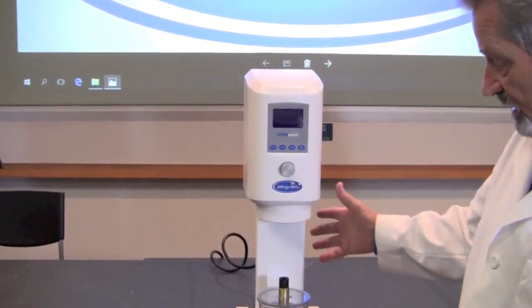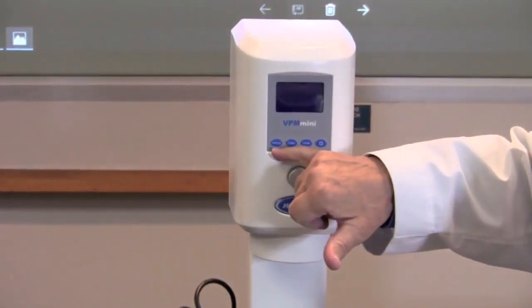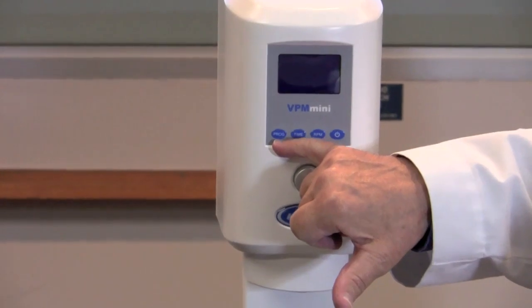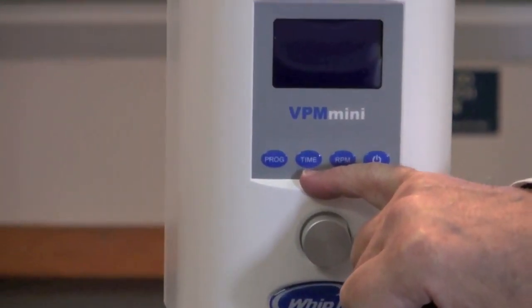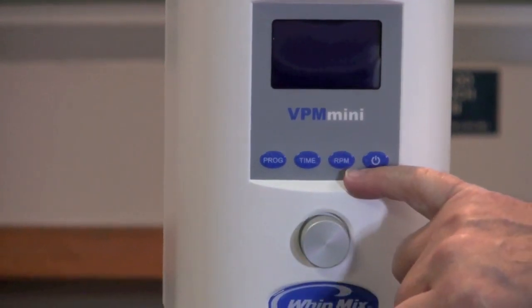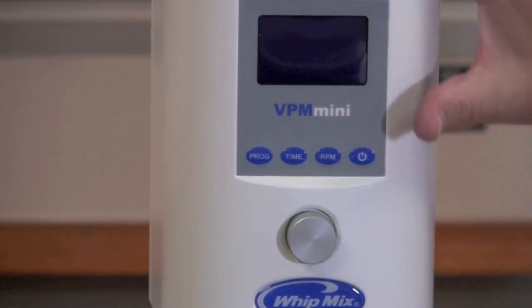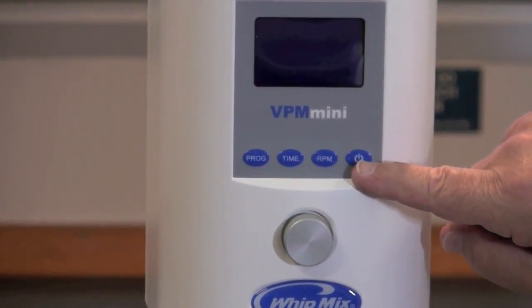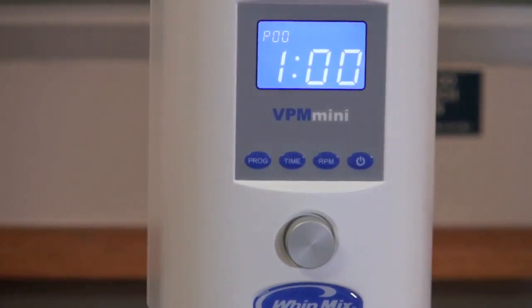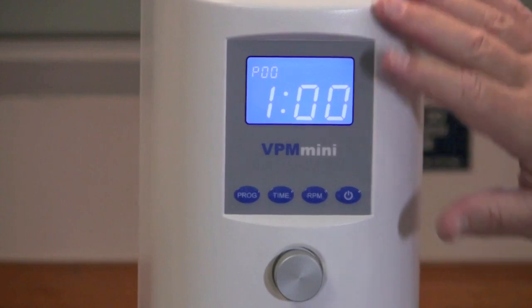So when you get this all set up and ready to go, you have some options in the Mini. You have the program that you're going to use, the amount of time that it's going to mix, and the speed or RPM that the paddles are going to turn. To get to that information, we're going to use the on/off button right here on the face of the machine, and it will bring up what's currently in your machine.